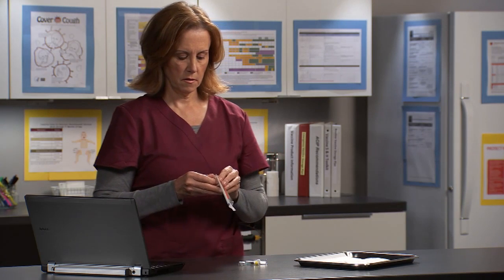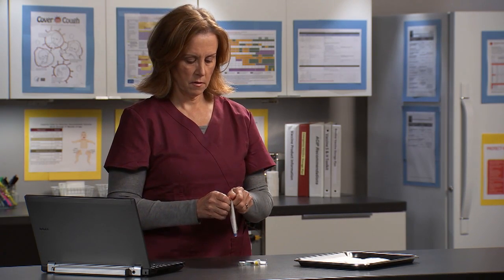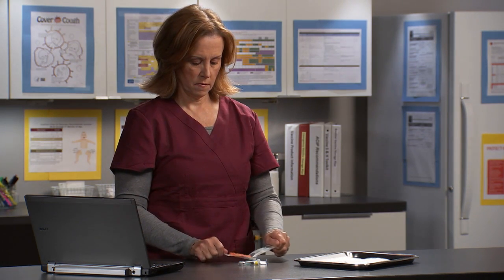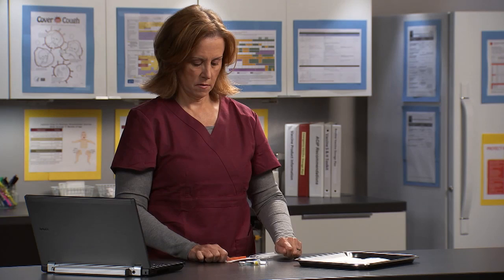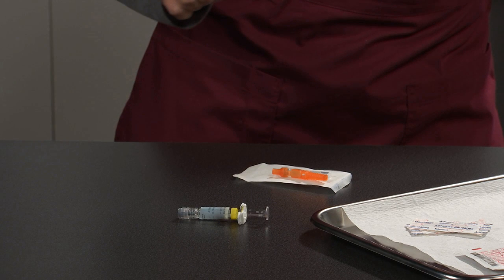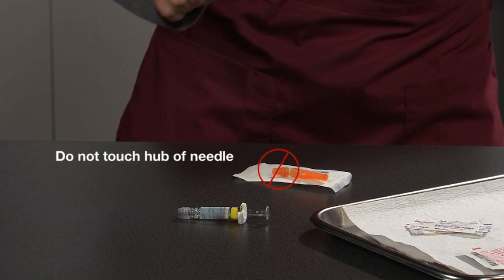Next, open the needle. Be careful not to touch the inside of the packaging. Once opened, place the packaging inside up on the counter. The needle should rest on the inside of the packaging. Do not touch the hub of the needle.